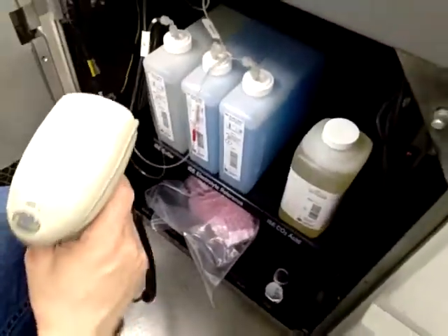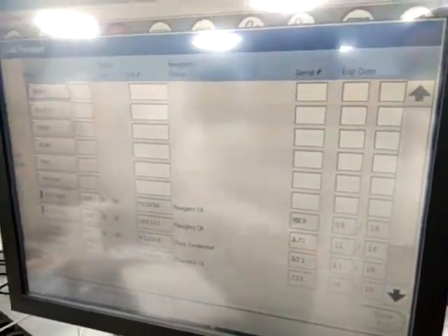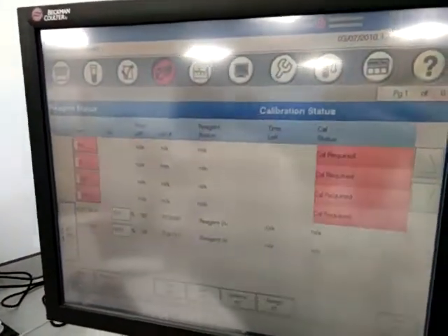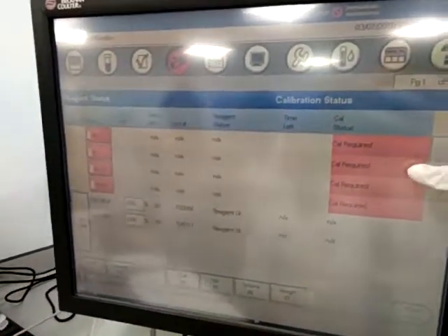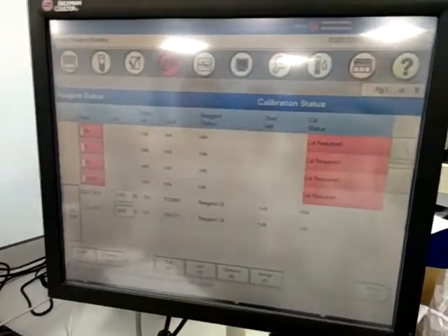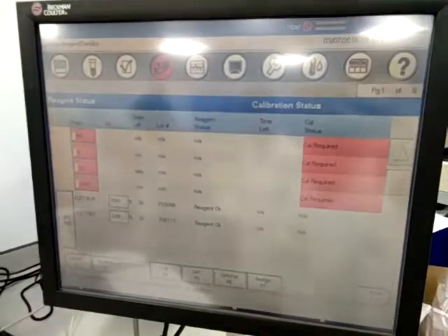Barcode? Yes. Okay. We will prime automatically. We will not do anything. No. Done. Okay. Reagent loading. Okay. Yeah. After this, calibration. Calibration. Okay.